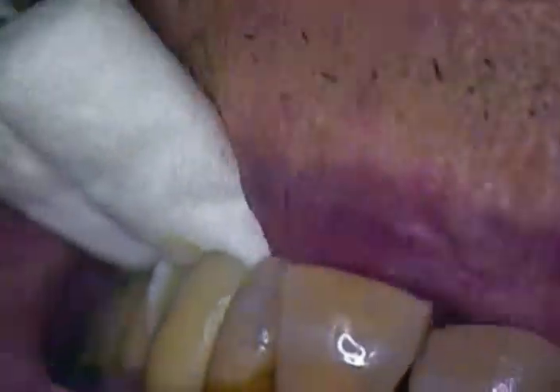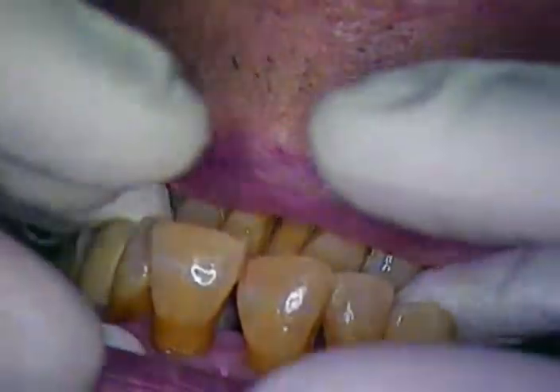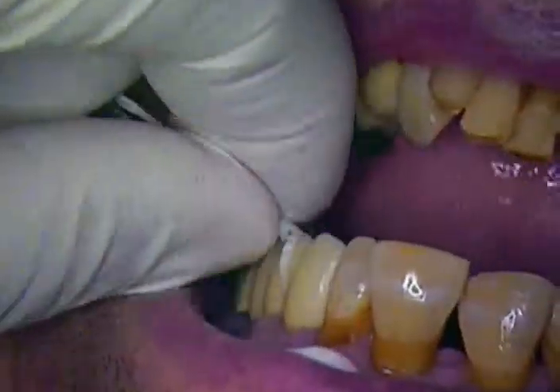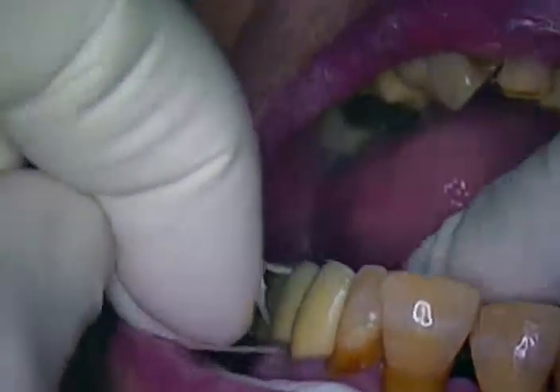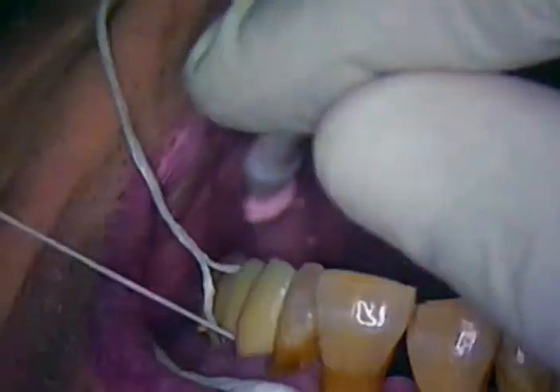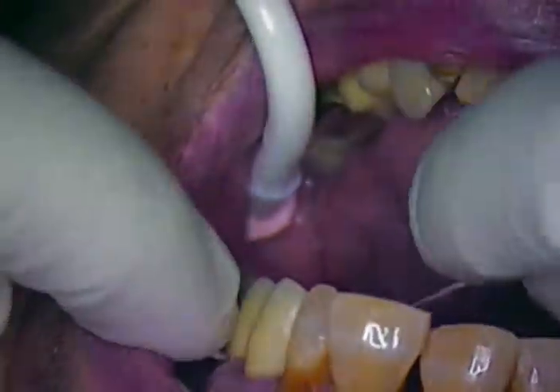We just cemented the case and the timer has gone off. We have two cotton rolls on this side holding the bridge and one over here so we got a good even bite. Go ahead and open now. We do use floss in between the interproximal areas to prevent any cement from catching in between the bridge. We'll release the first one — their sole purpose is to prevent cement from getting caught in the interprox. We'll run that in between several times, pass it through, send it through the contact zone. Notice there's minimal cement; we used Bendex brushes as the cement was setting to clean away the excess, so we go through about four to five of those in each case.